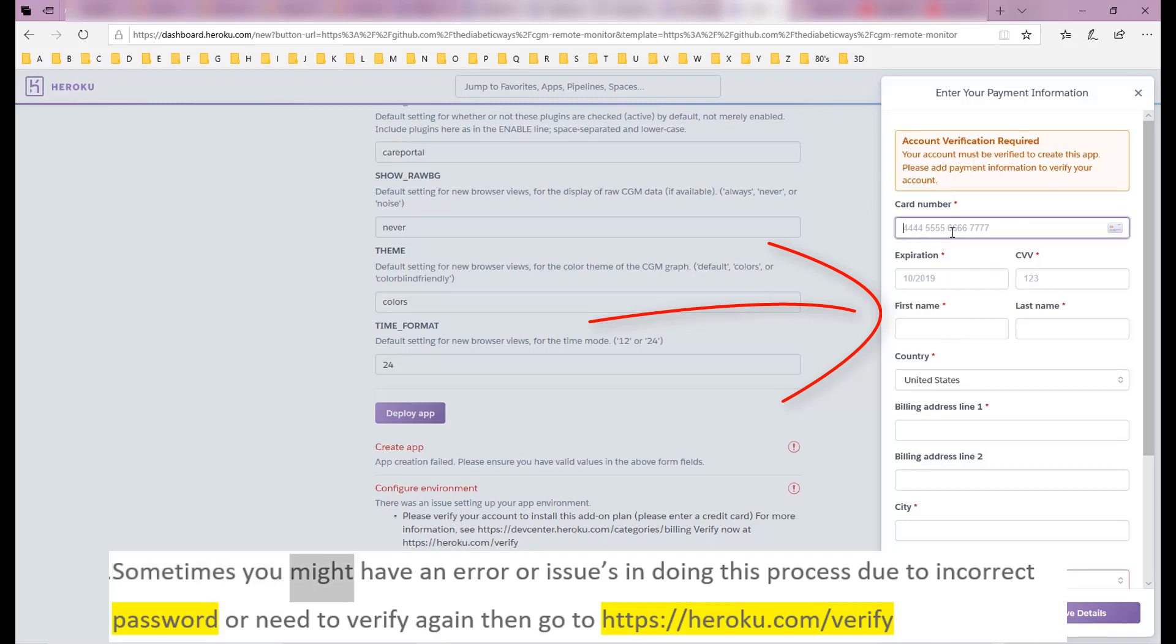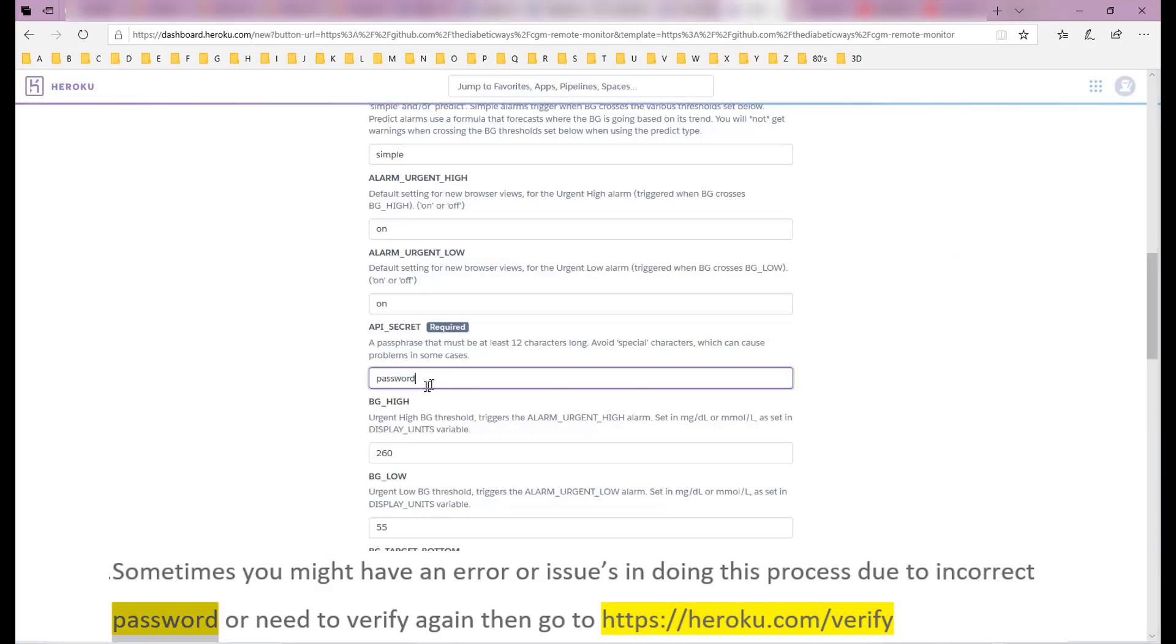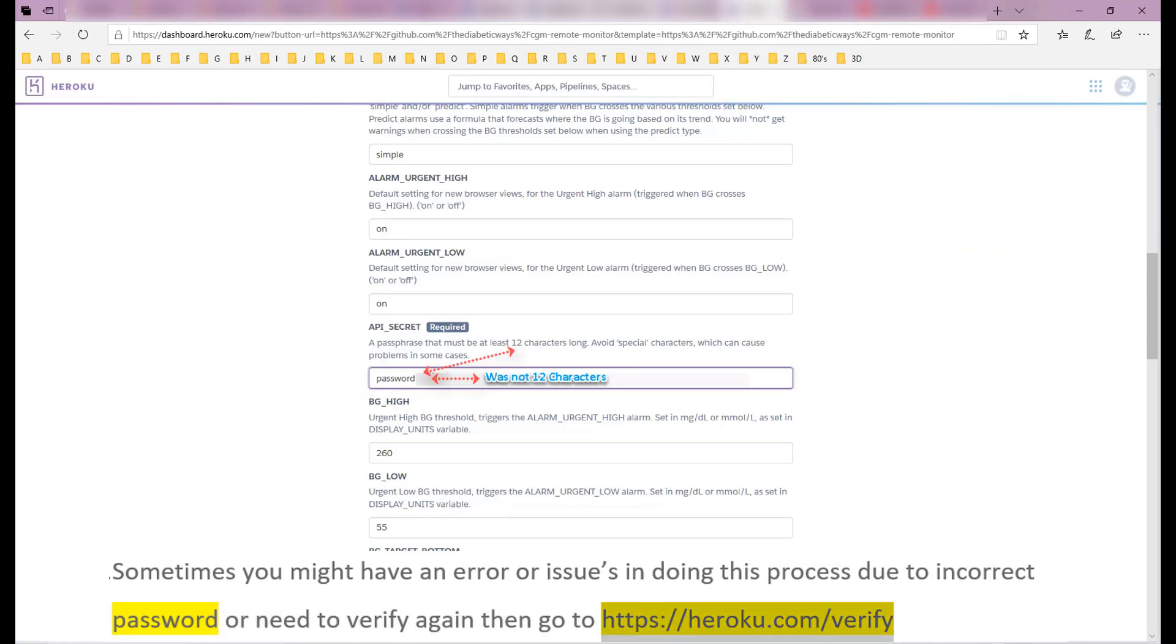Sometimes you might have an error or issues in doing this process due to incorrect password or need to verify again. Then go to https://heroku.com/verify.